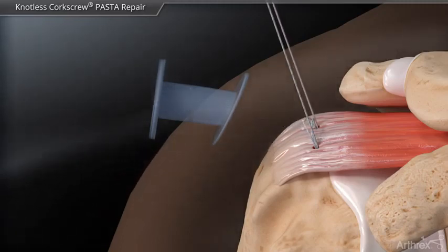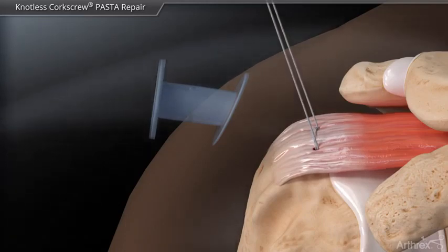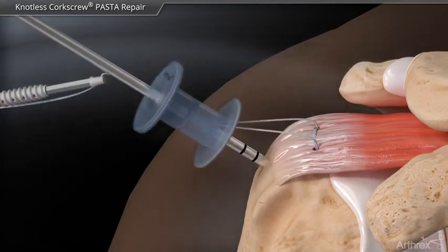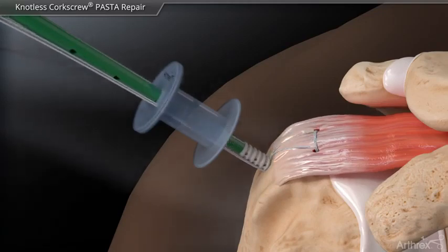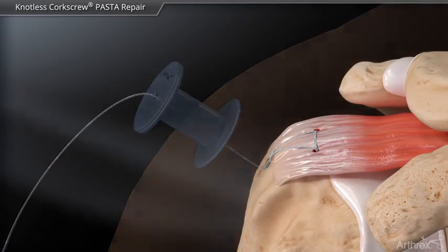At this point, both sutures are pulled to tension the bridging sutures between the anchors. The remaining suture limbs are then retrieved out laterally and compressed into a 4.75 biocomposite swivel lock anchor laterally to complete the bridging construct for footprint compression.